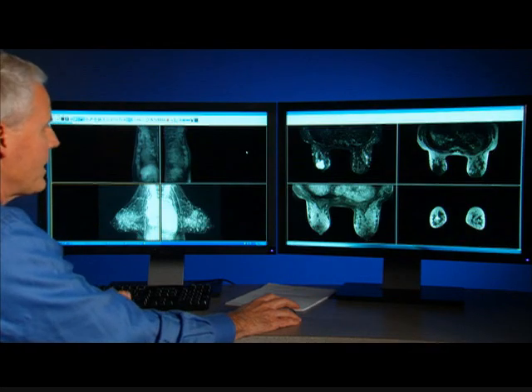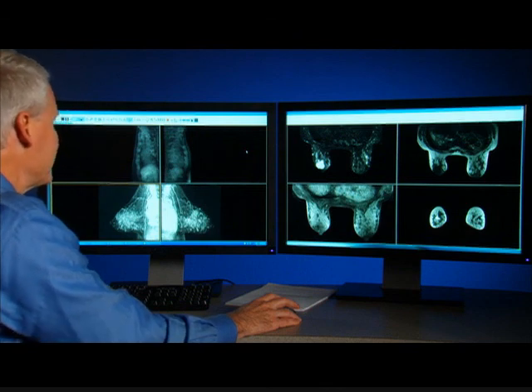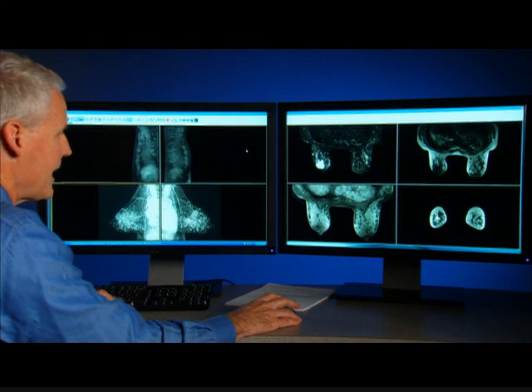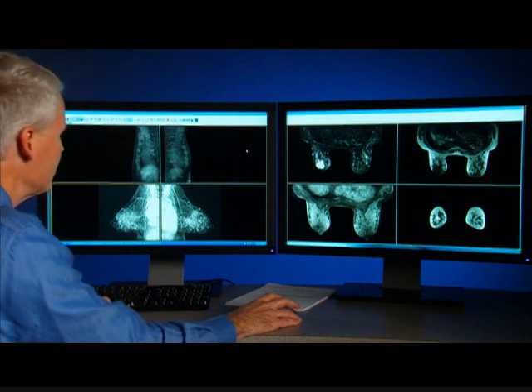As we go to the breast MRI, I thought that it would be good to bring in sort of another extreme. You know, we've been showing cases that have fairly isolated lesions, not too difficult to find.